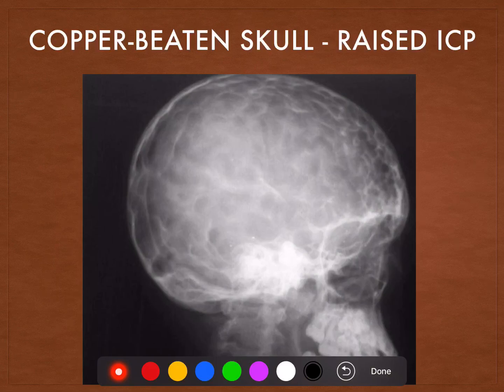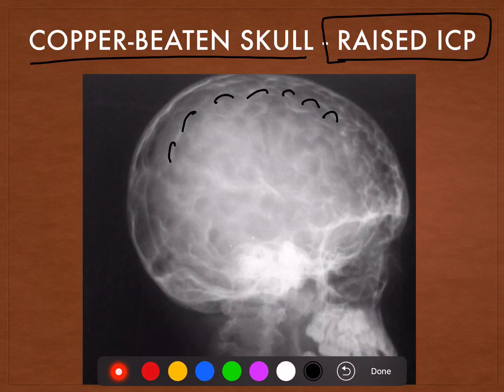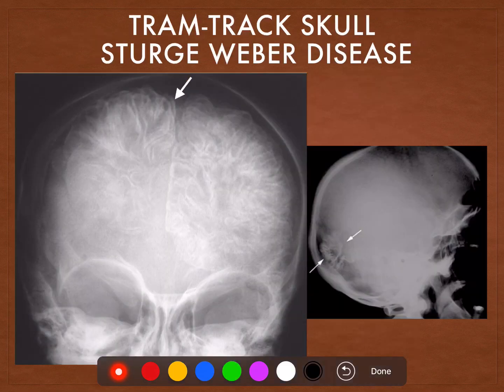Again, in this skull of a young patient, we see these multiple gyral impressions. These lucencies that you see are actually the gyral impressions of the cerebral hemispheres and this is known as the copper beaten skull, which is characteristic of raised intracranial pressure in a child. Gyral impressions leading to copper beaten skull.